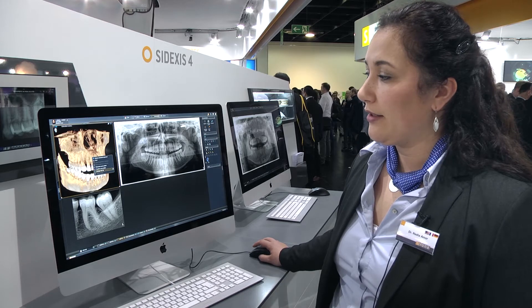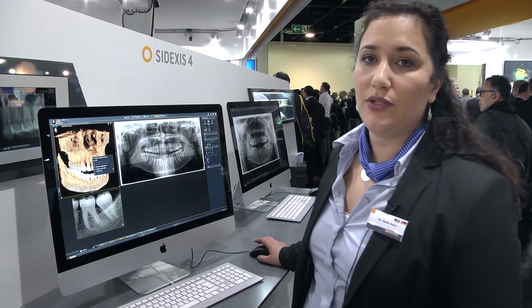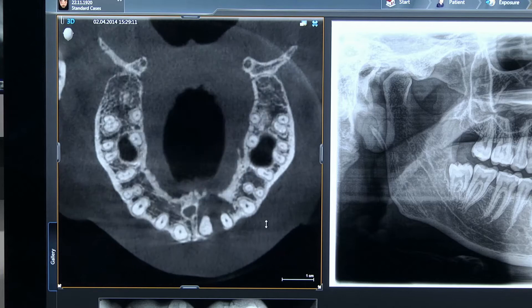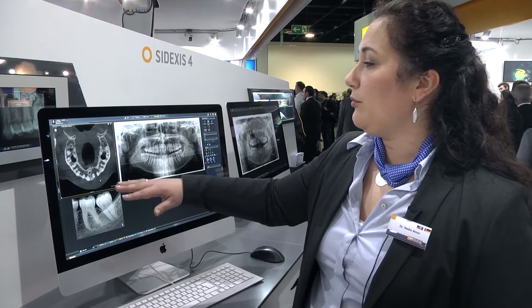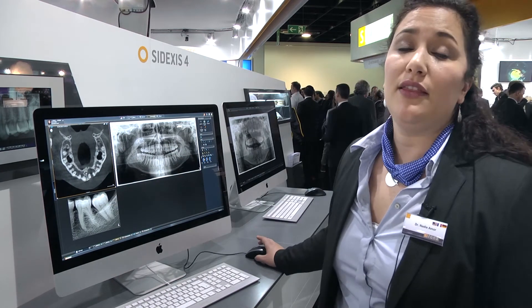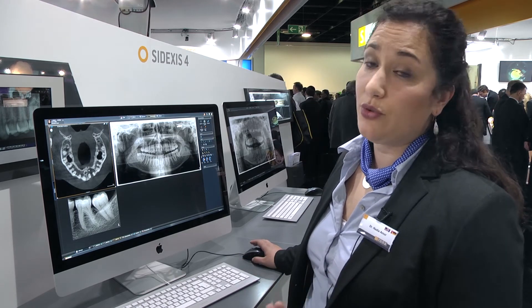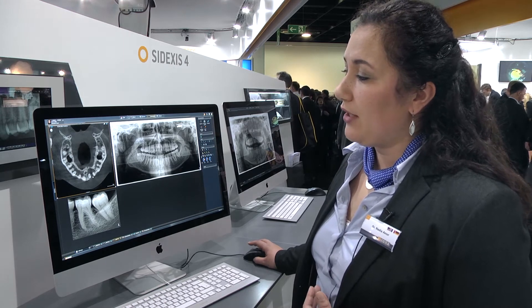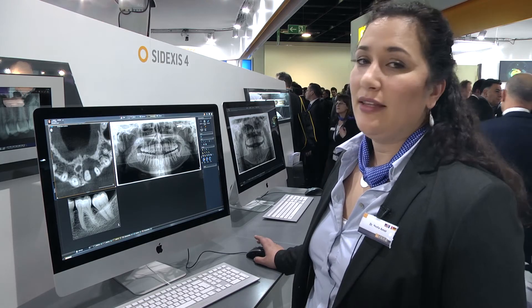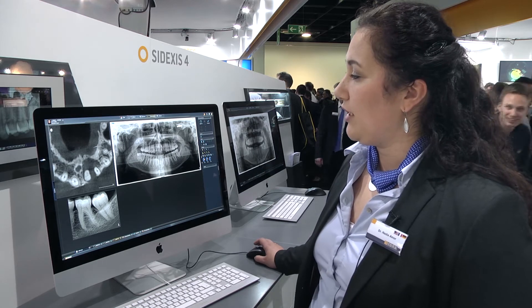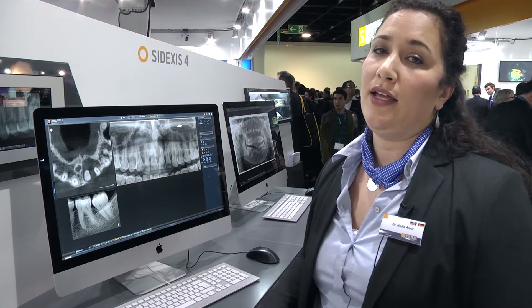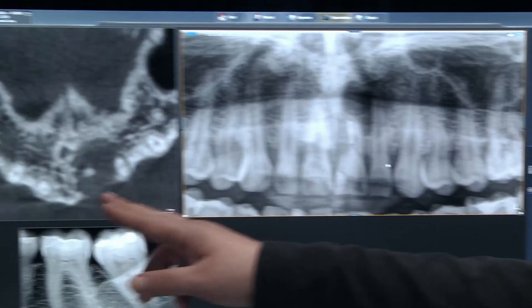With just a click I can change the view, for example to the actual slice, and then I can really navigate through the entire scan. That is really unique — you won't find that anywhere else. You can do the direct cross comparison of your 2D image and your 3D image. When I want to zoom into a pathology, I just bring the mouse cursor to the point of interest and quickly use the mouse wheel to zoom in. The exact same navigation works in the 2D image — bring the mouse cursor, zoom in, and now you can do the comparison and really see details that you could not see before.